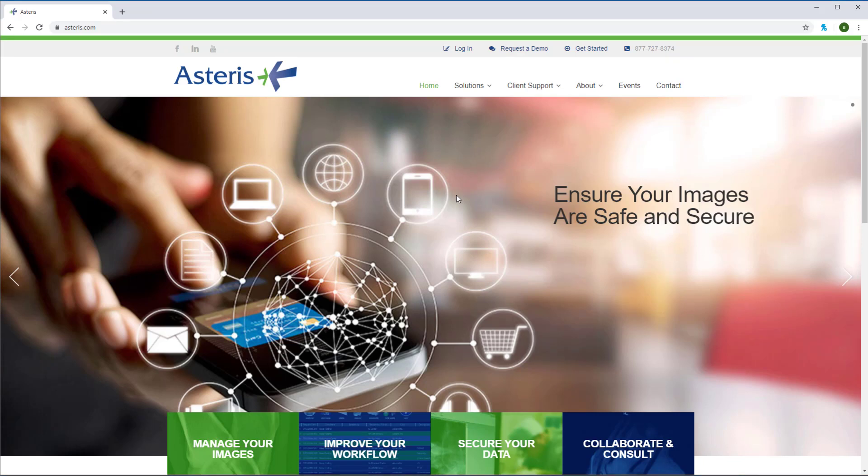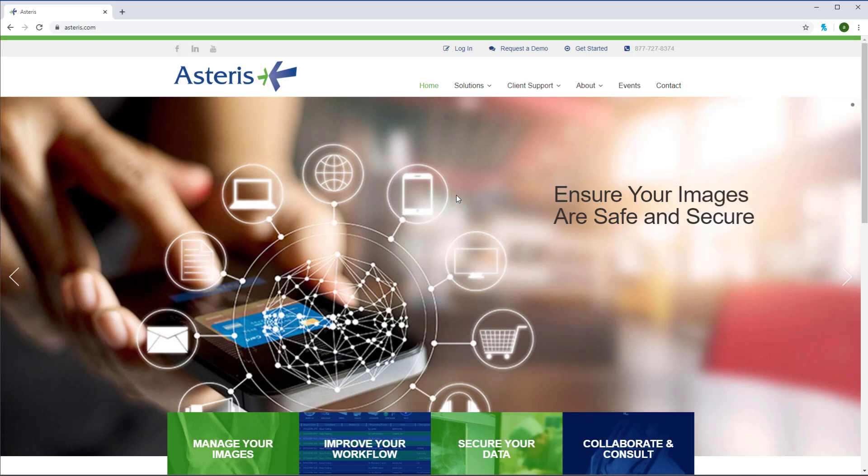Hello and welcome to the Keystone Community training session. Keystone Community is a web application that facilitates the transmission of DICOM studies to a specific specialist or consultant. DICOM images are known as digital imaging and communications in medicine. DICOM is used worldwide to store, exchange, and transmit medical images, enabling the integration of medical imaging devices from multiple manufacturers. Patient data and related images are exchanged and stored in standardized format known as DICOM. Keystone Community is not intended to be a primary image viewer but a portal for data transfers to your desired consultant. Let's get started.